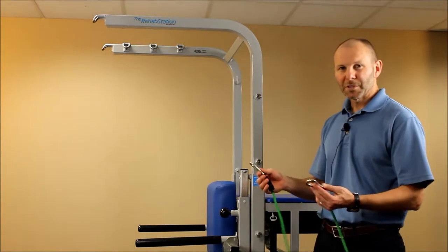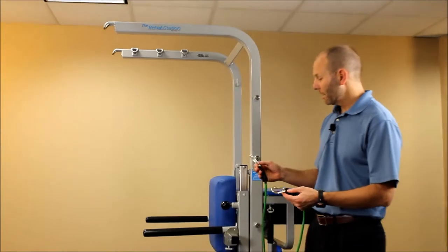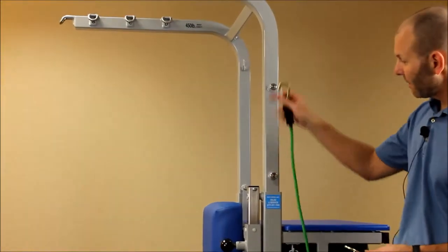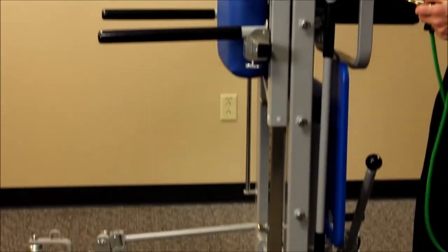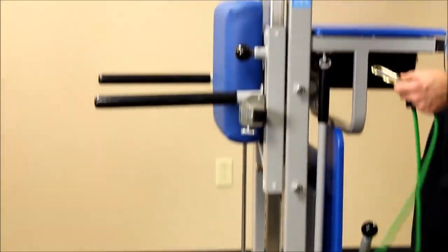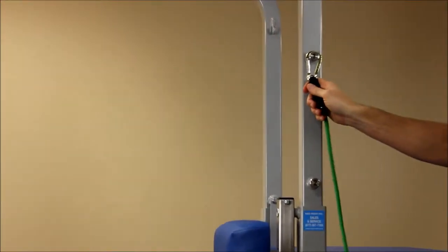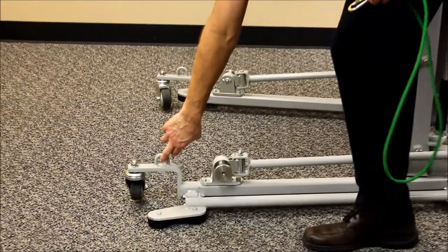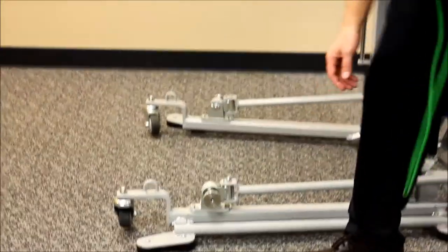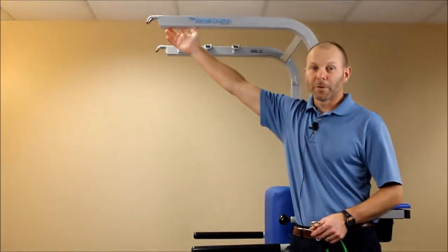I want to cover a couple of simple tips and tricks about how to use these in your everyday use with the patient. You can attach these to any number of areas on the rehab station. On the side you'll see numbered pegs from one through six, top to bottom. We also have an area lower on the front arms to clip as well, and you can also clip up to any of the overhead supports.